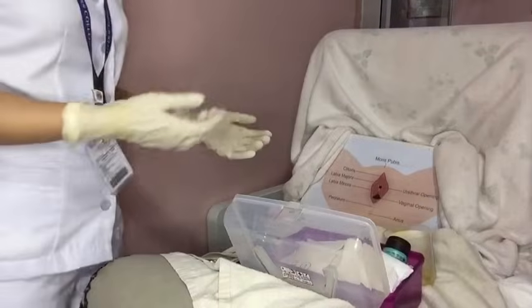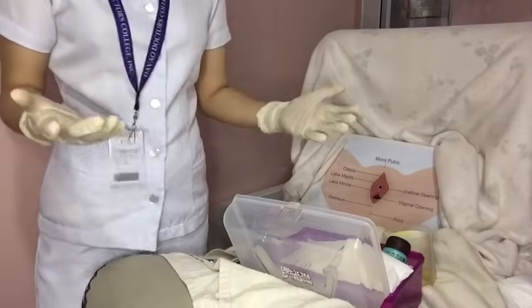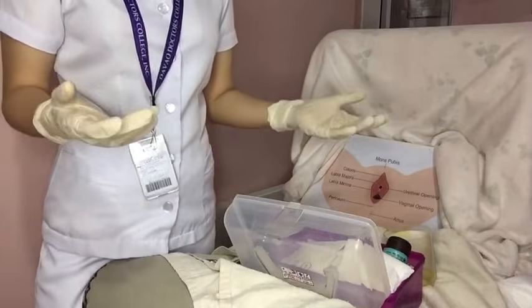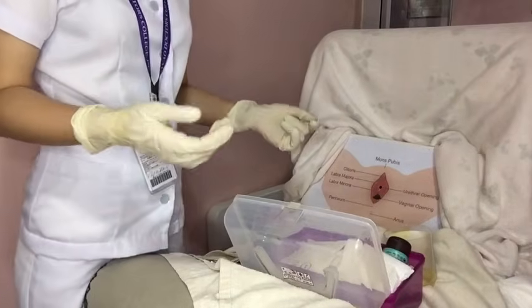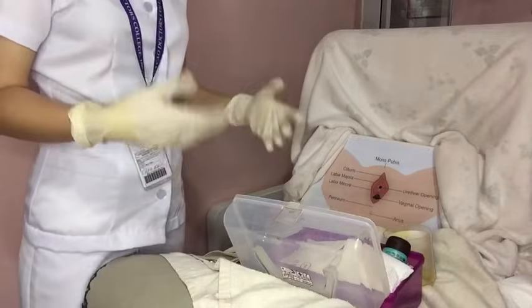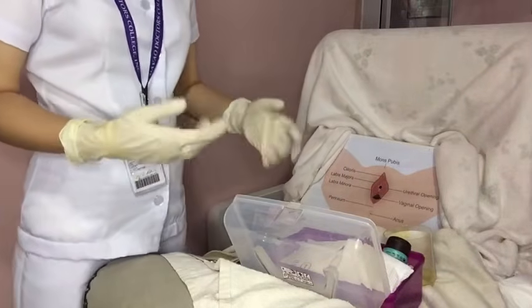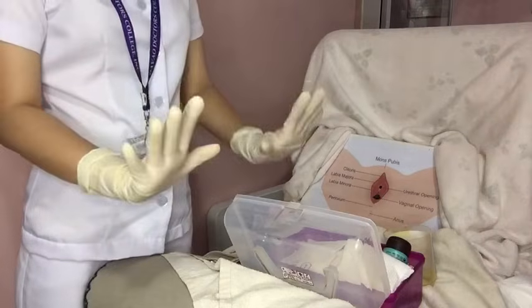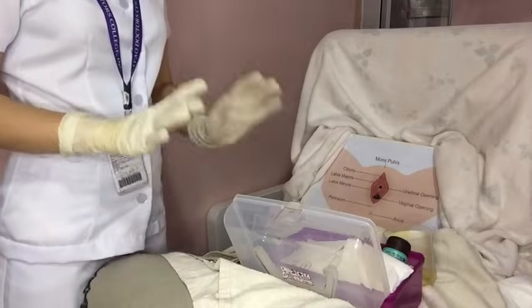Now use the sterile forceps to cleanse the area using the cotton ball with betadine. This is done because thorough cleansing of the meatus and the surrounding area reduces the possible introduction of microorganisms into the bladder. Open the set, put on the gloves to prevent the spread of microorganisms to the client, and of course put on the eye sheet.